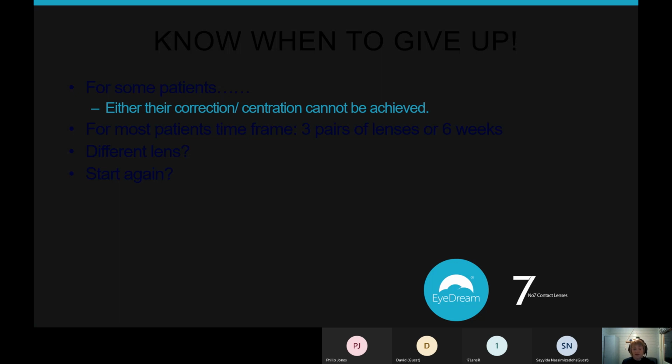So if it's for myopia management, we're really fortunate that we've got MiSight and Natural View and spec options, and there is likely to be something there for your patient. And for adult patients, we've got all sorts of other products. They might not give them all the benefits of Ortho-K, but hopefully we can find something that works for them.